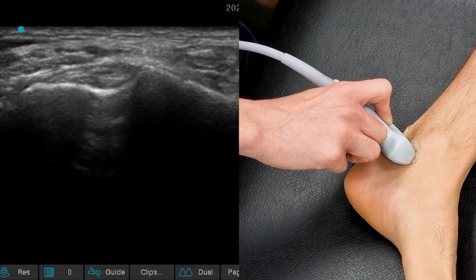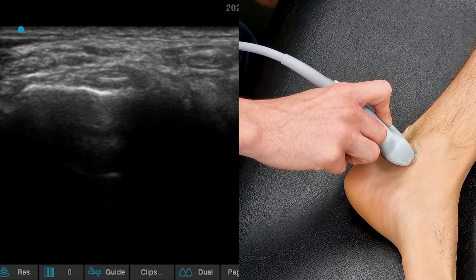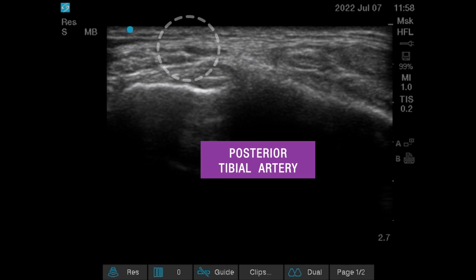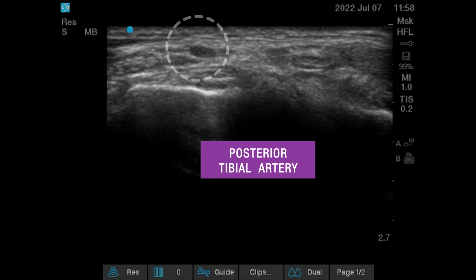Now if we move the transducer to the medial ankle, we can demonstrate the posterior tibial artery. You can see it pulsing nicely in the middle of the image. We use ultrasound in this way in clinical practice if we're finding it difficult to palpate the posterior tibial artery.